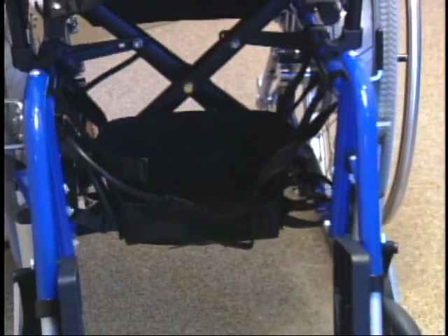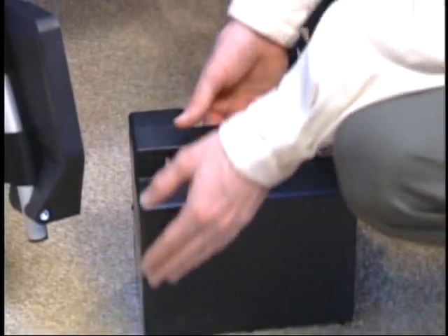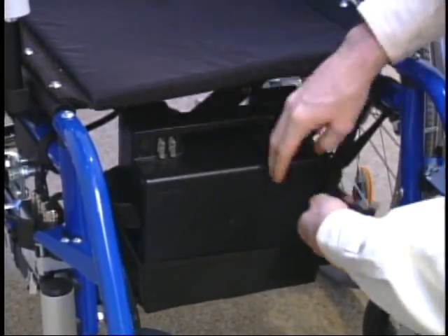With E-Fix installed, wheelchairs remain foldable for easy transportation. The E-Fix battery pack is one of the lightest battery systems in the industry.